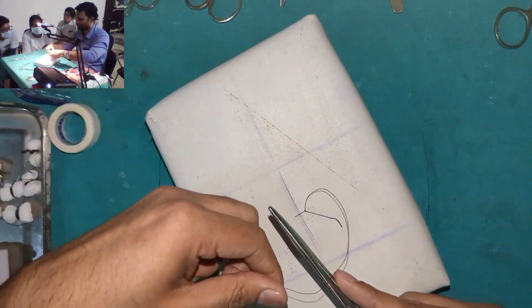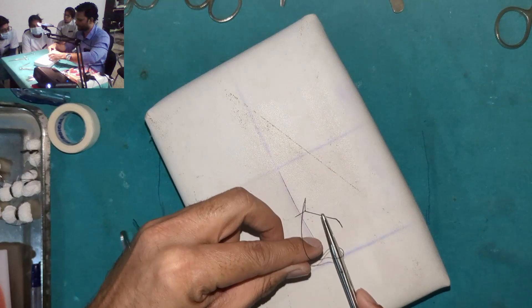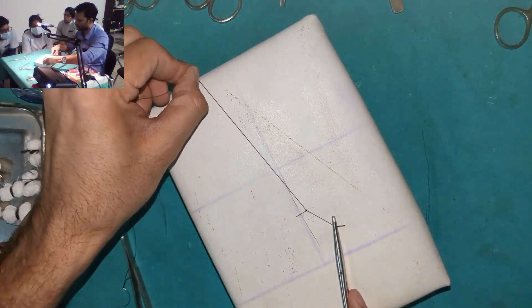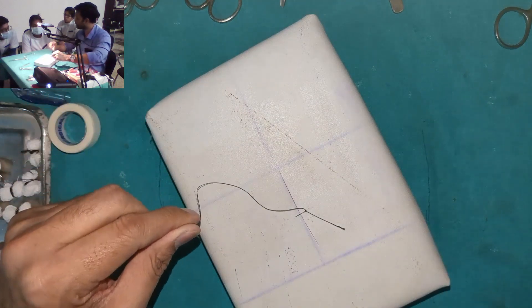So this was one throw. Then we throw in opposite direction, that is anticlockwise. I hold this again, I am going to use it as a guide. Can you see?